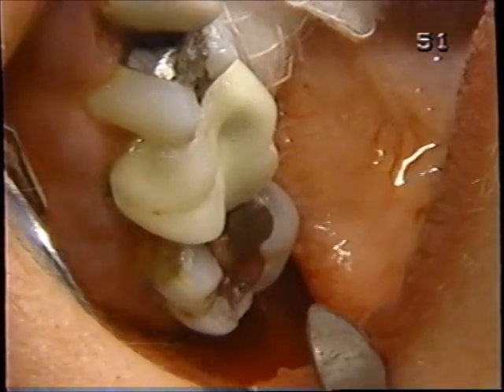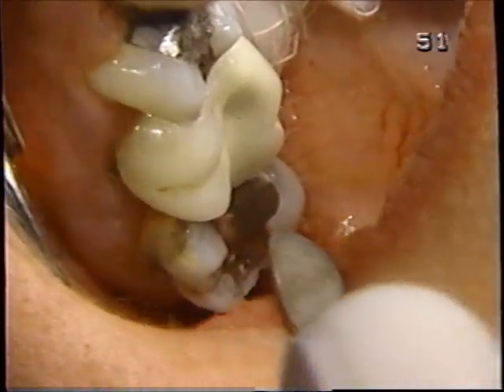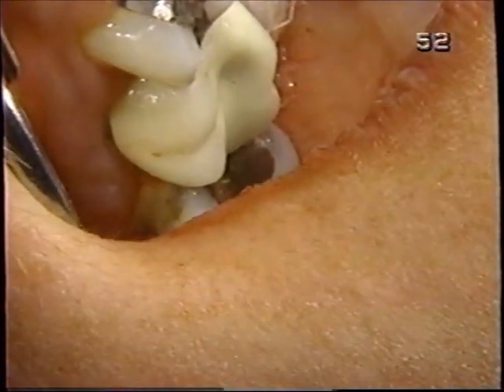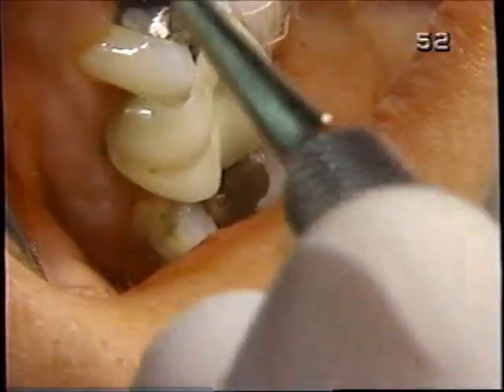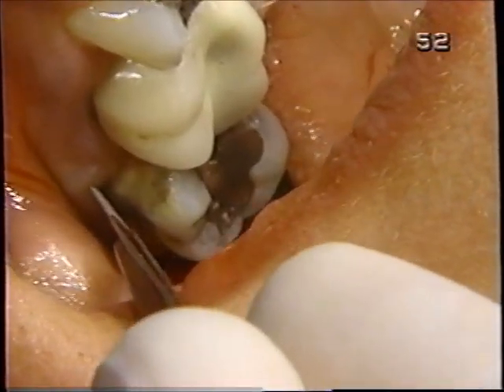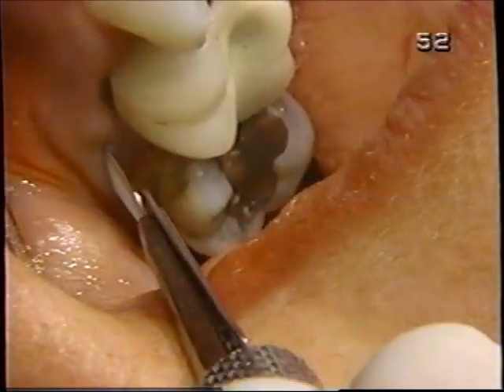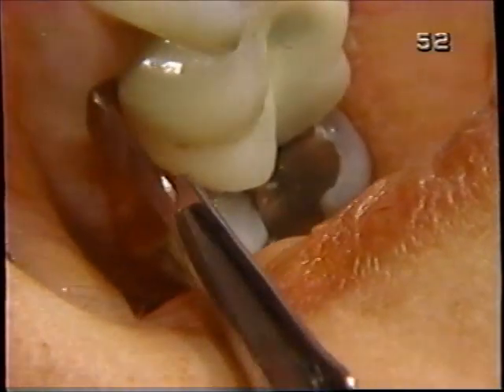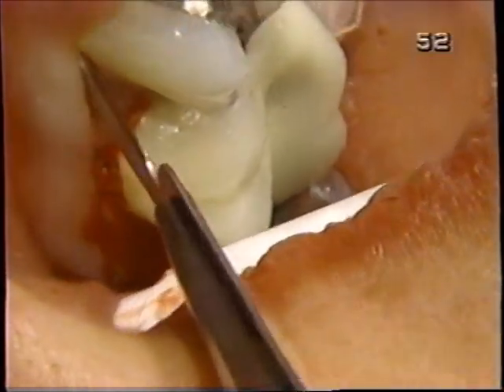The first thing we'll do is take the Bard-Parker and excise the papillae that are diseased and that would need to be removed anyway. This will just facilitate that, expedite that. We don't want them there. They will just retard healing, their presence.